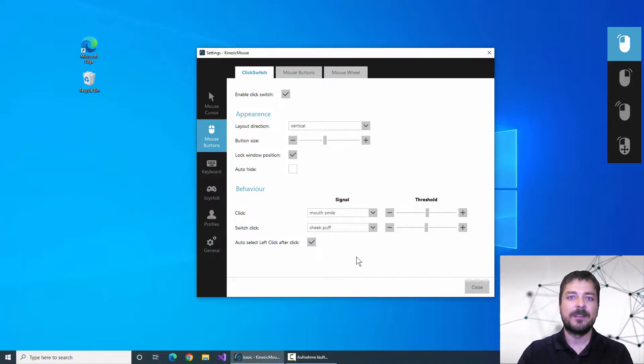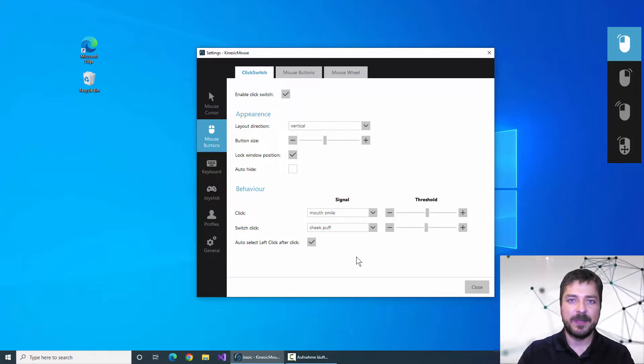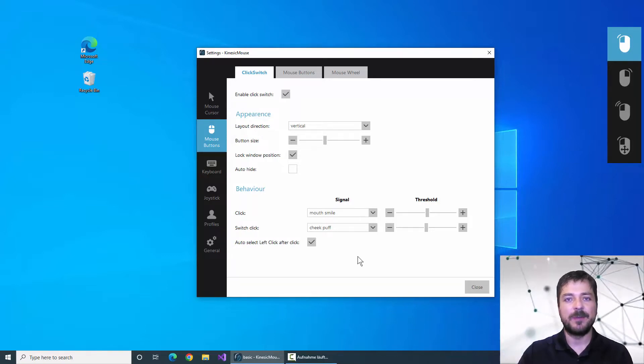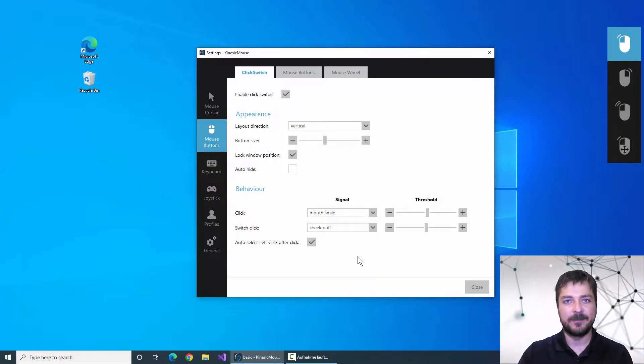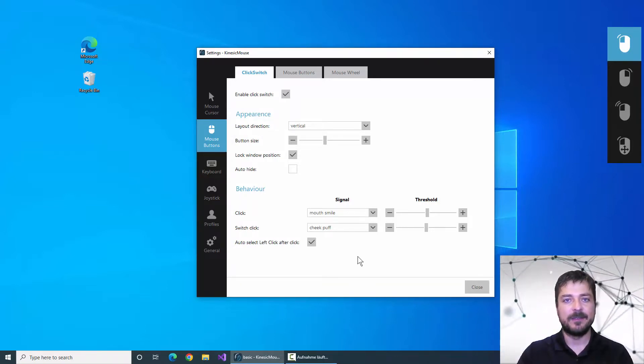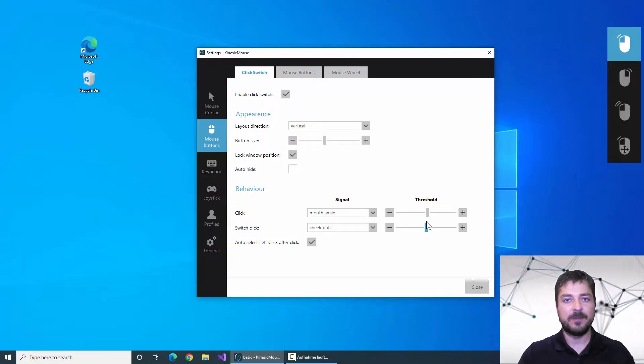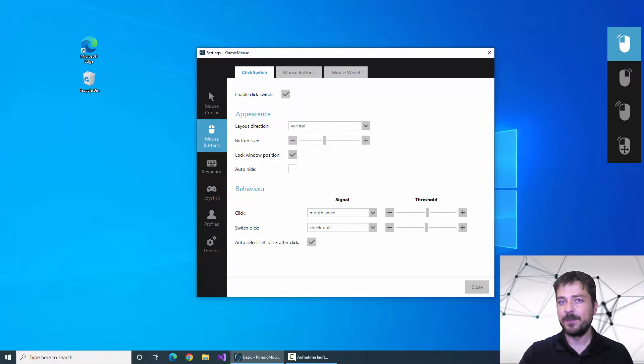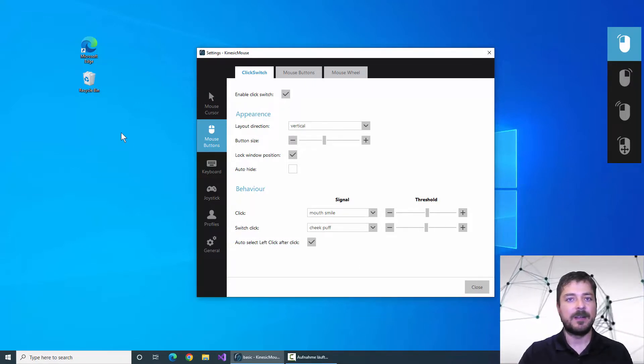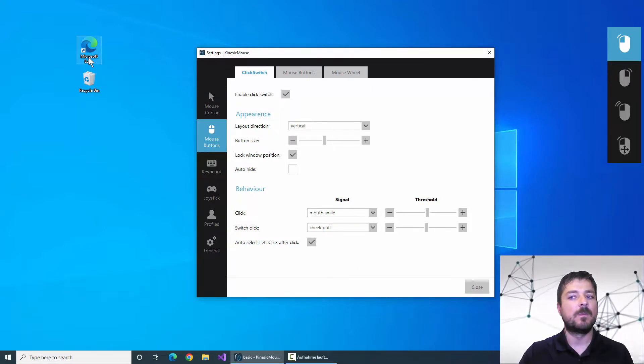The click switch menu will always jump back after performing any other click than the left click. So let me unpause the Kinesic Mouse and perform a double click now on this icon up here.